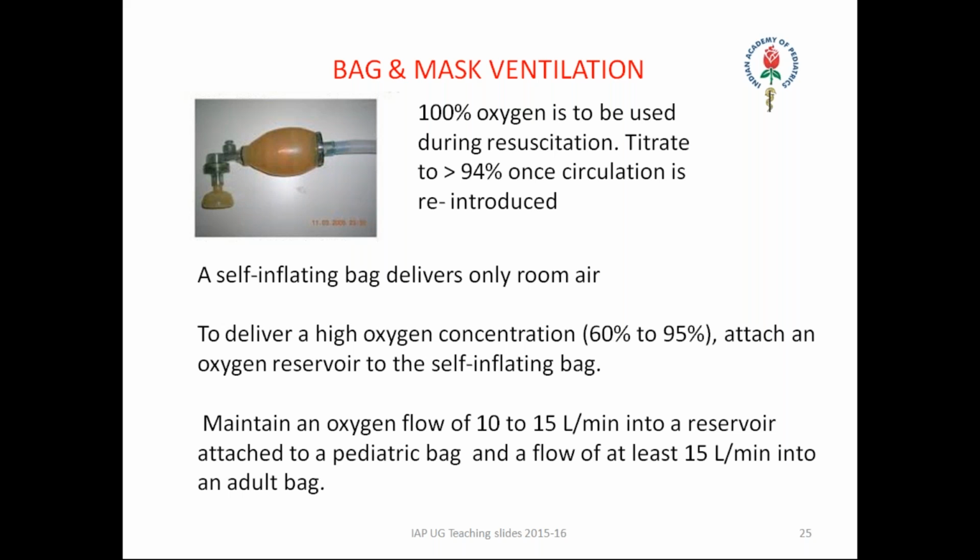What is the correct size? How do you know the mask which you are using is the correct size? The mask should adequately seal the nose and the mouth and a part of the chin, but it should not cover the eyes.